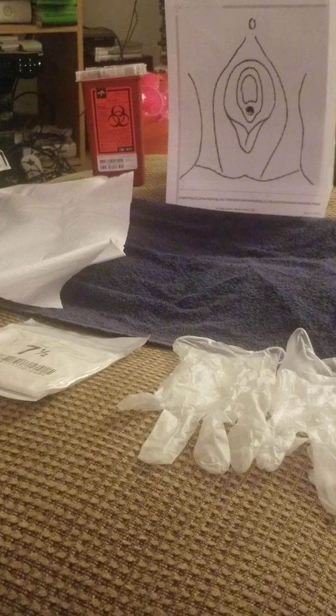So now I will be going over to my kit that I hope is my right kit. The reason I say that is because looking at the directions and then looking at the contents of my kit, I don't see a Foley catheter that has a balloon at the end. The kit that I received looks like a straight cath kit, which is fine because I could still use it and do what I have to do. I have to do whatever I can to empty this patient's bladder. So I will do that.